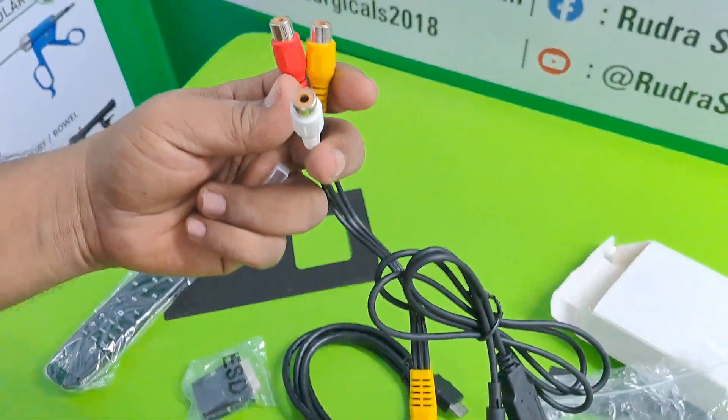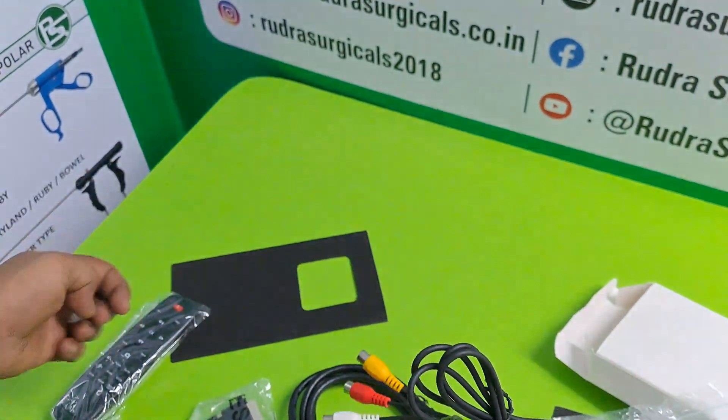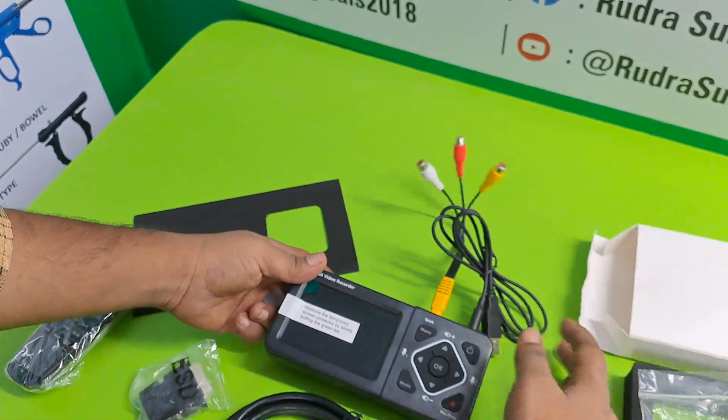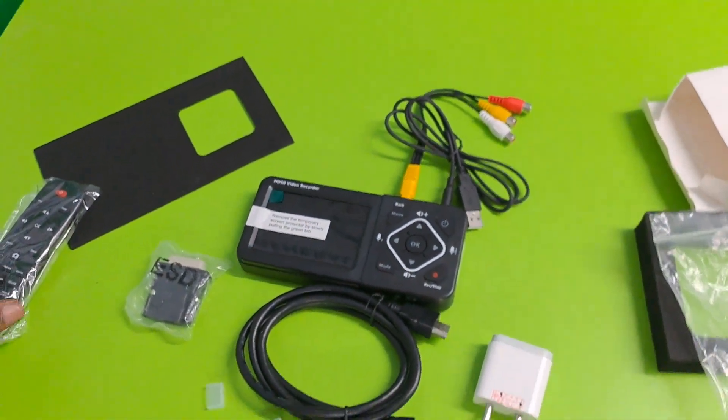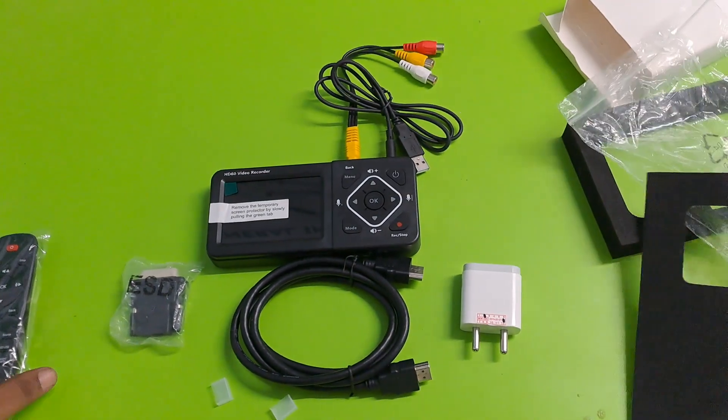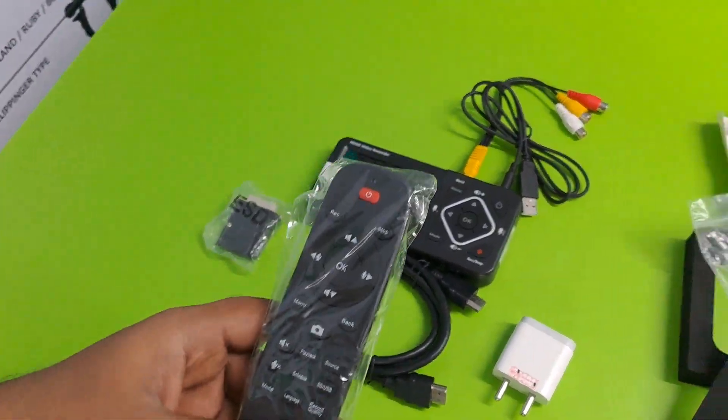Now you can connect to a monitor, as well as TV. Also you can access this from remote.